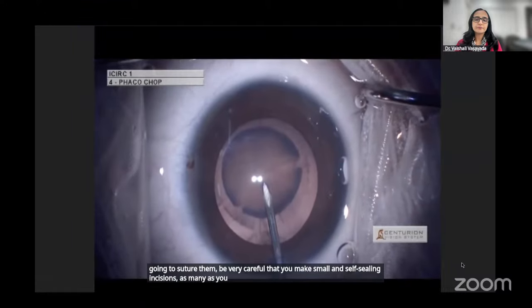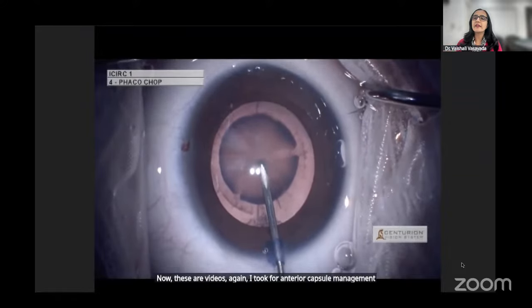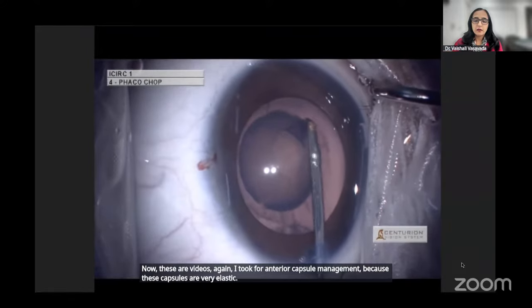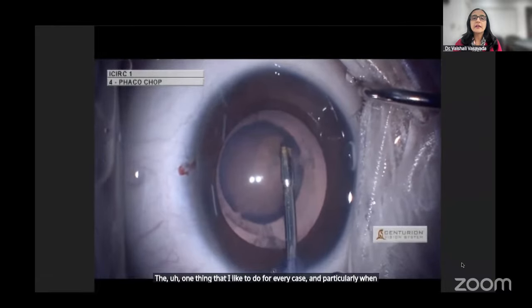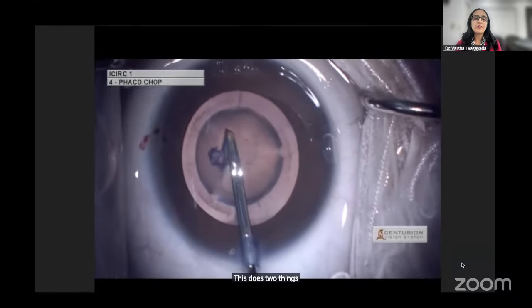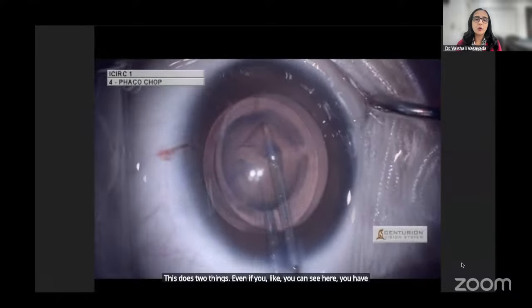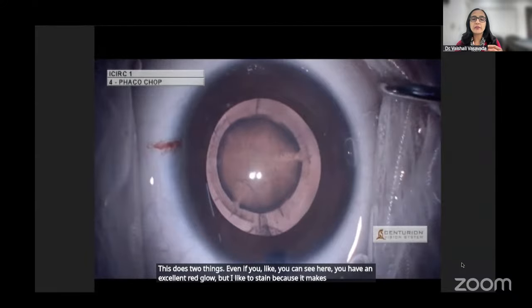Even though you are going to suture them, be very careful that you make small and self-sealing incisions, as many as you need. Now, these are videos, again, I took for anterior capsule management, because these capsules are very elastic. The one thing that I like to do for every case, and particularly when I was learning, is to stain with trypan blue. This does two things. Even if you like, you can see here, you have an excellent red glow. But I like to stain because it makes the capsule more visible at all times.